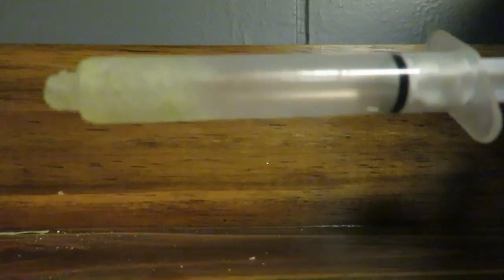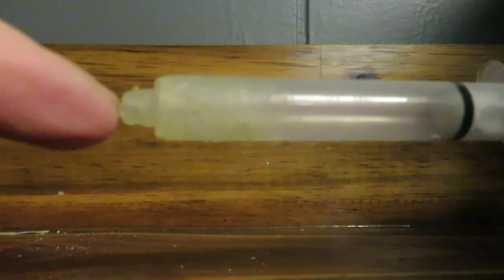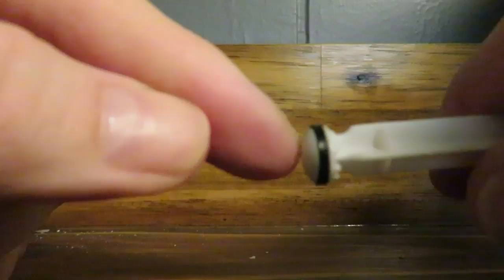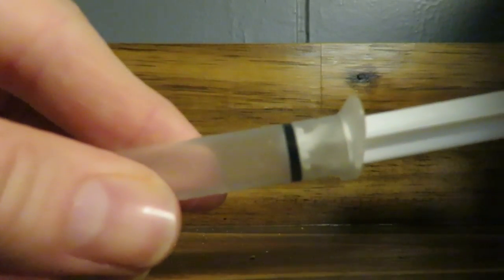Today's quick tip is about hand feeding. This three mil syringe has been well loved — I've cut part of the tip off for hand feeding. When you use the same syringe over and over again, you're often going to find this black stopper starts to get stuck and is really hard to push through.